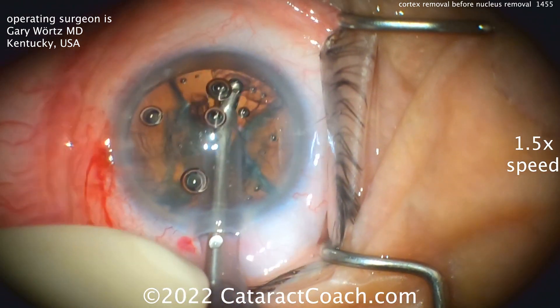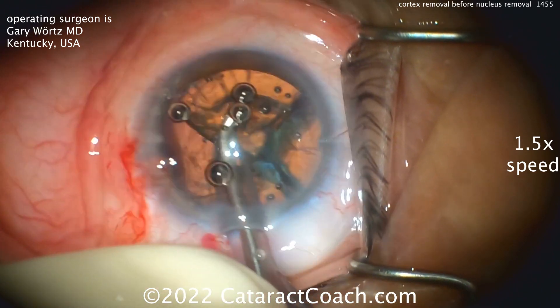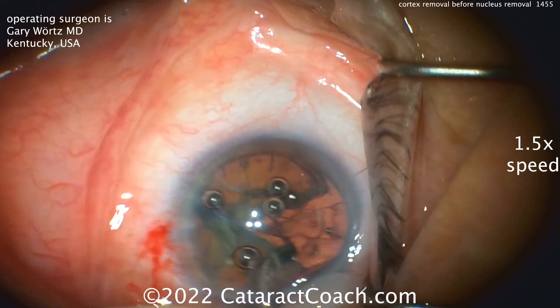Look how he rotates this, takes out some cortex from this quadrant, and then rotates it again. I thought that was pretty clever. Watch carefully — this patient's going to keep moving a lot. I get the safety here. It makes a lot of sense to me.